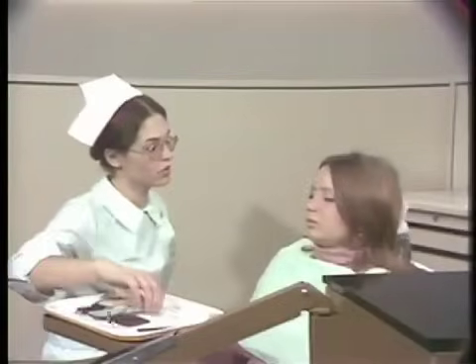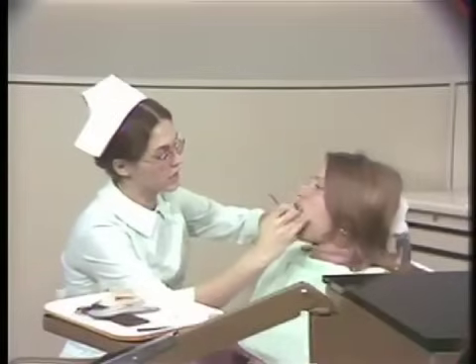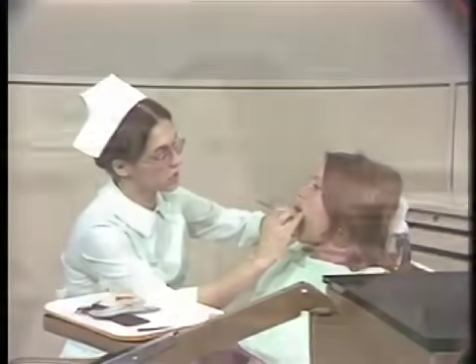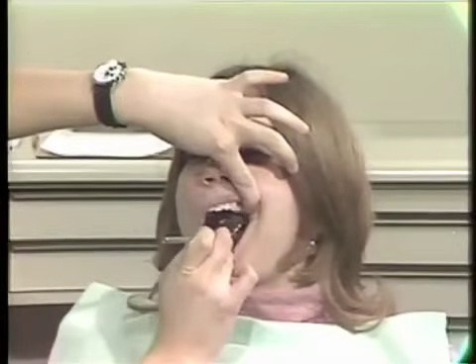I'm now going to check the posterior occlusal of the teeth for wear facets. I notice that you're missing your first bicuspids. Have you had any orthodontic work? Yes, I did about eight years ago, and I had four teeth extracted at the time. I see.